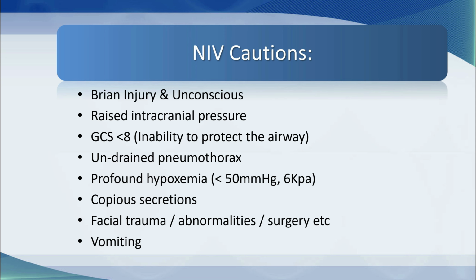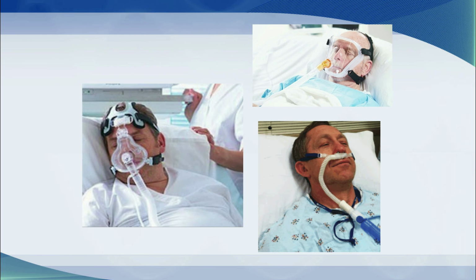And the one case where we kind of run into a bit of discourse about that is in patients who may or may not have a leak in their esophagus after esophagectomy. You can use a whole variety of different devices for non-invasive ventilation. Usually it's a facial mask that covers the nose and the mouth.